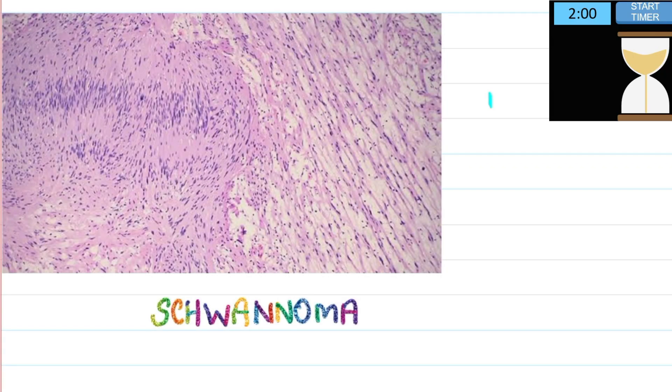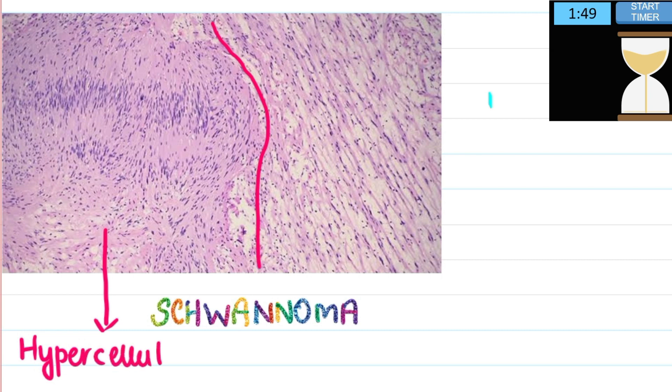The image is that of a tumor known as schwannoma and this image has two distinct areas. On the left we have lots of cells, so that is the hypercellular area, and on the right we have less cells, a loose tissue that is a hypocellular area.